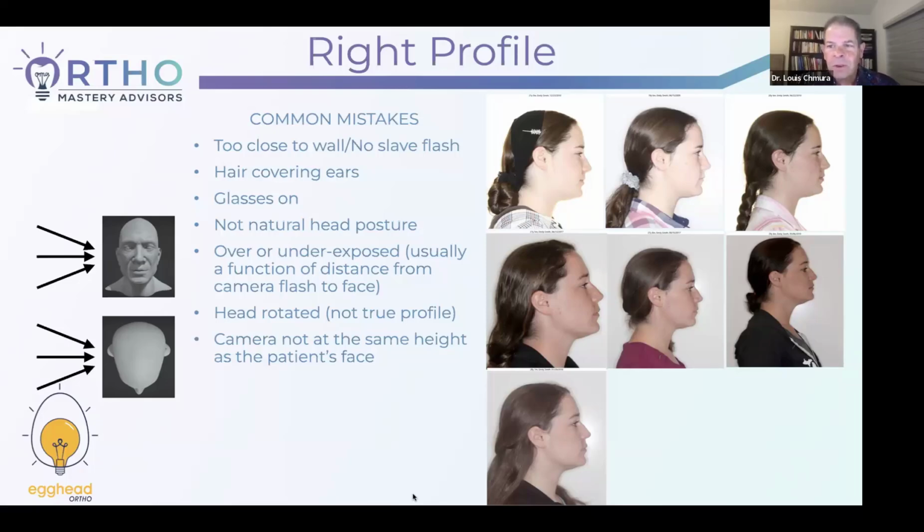The other thing is we can sometimes get pictures like this where they're rotated a little bit towards you. You should not see the other side, the eyelash on the other side. Okay? You want a true profile of the patient.